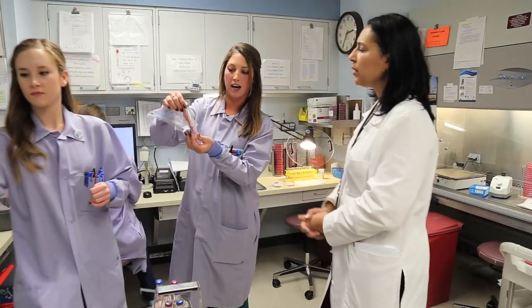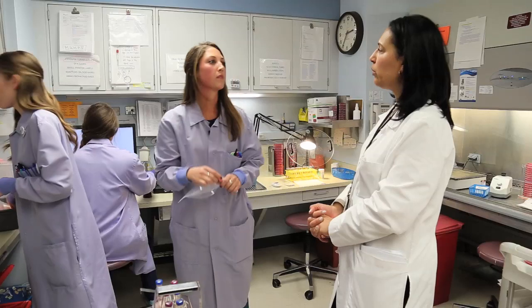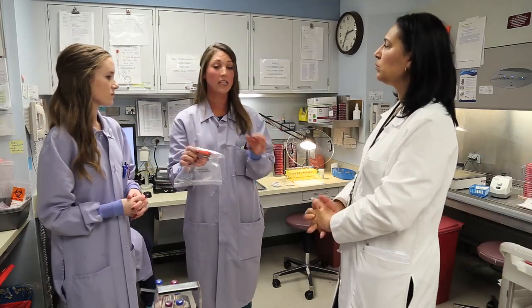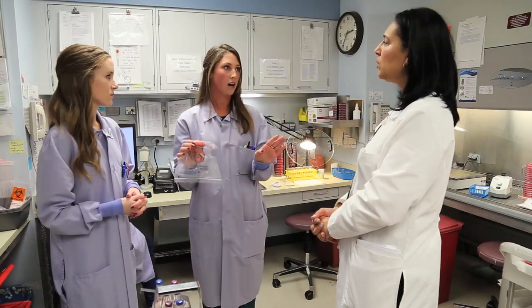Okay, and that's dark. Yes, it's a black cap, clear glass tube with this clear gel at the bottom, for anaerobes. But this is kind of a last case scenario. We would much prefer the fluid, even if it's just a drop, even if it's just a biopsy of tissue. We would prefer any of that.